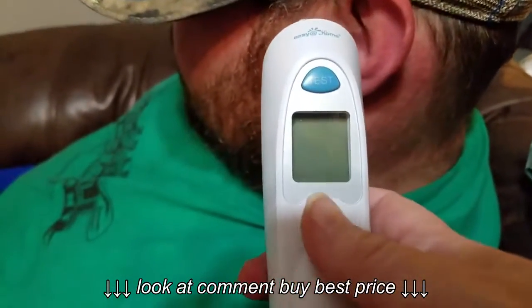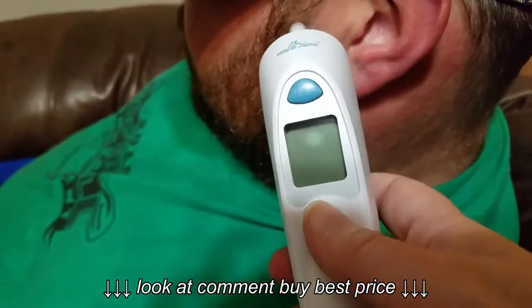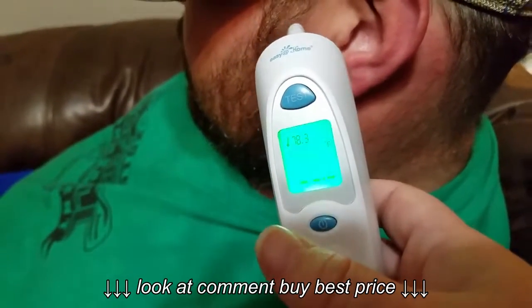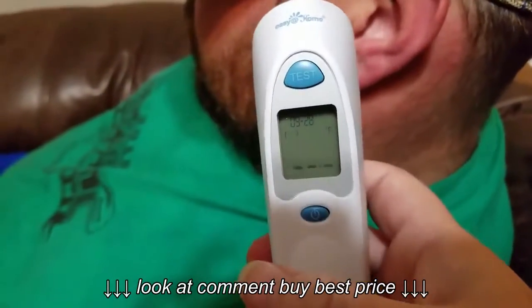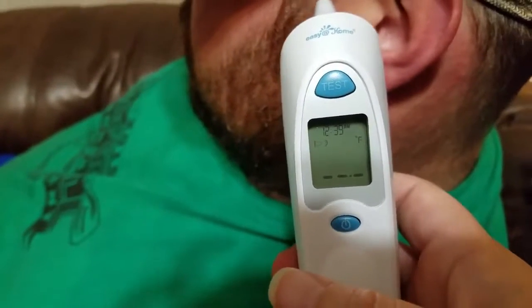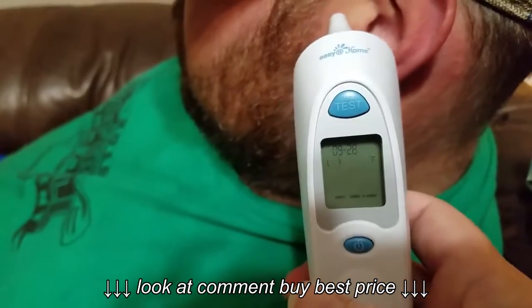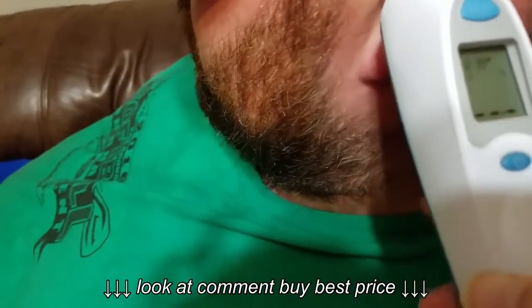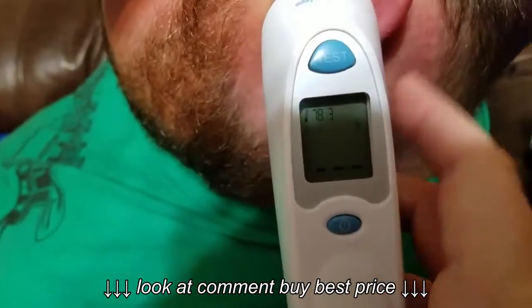Alright, so to take a temperature with the Easy at Home digital infrared thermometer, just turn the power on, wait for it to beep twice to indicate that it's ready. If you can see on the dial now, it's got the little ear icon that shows it's ready to take an ear temperature, and it has a little icon next to it that just shows that the protective probe cover is in place. So you stick the probe in the ear canal, and then you hit the test button.